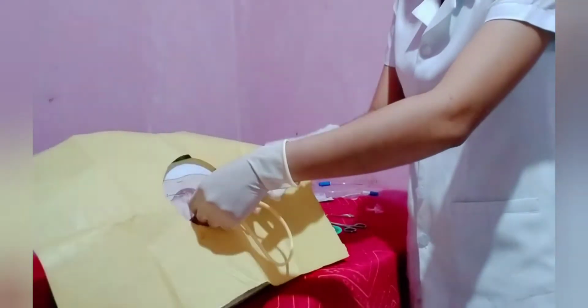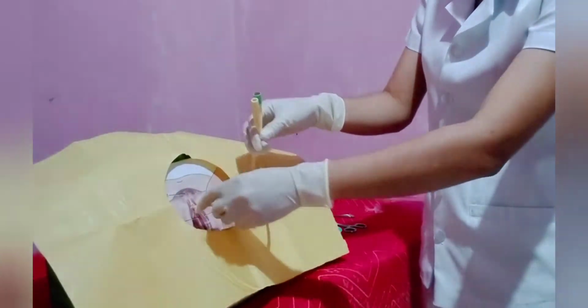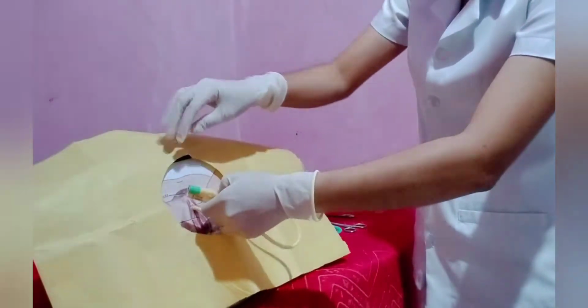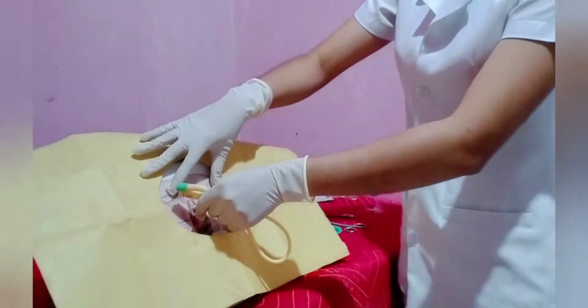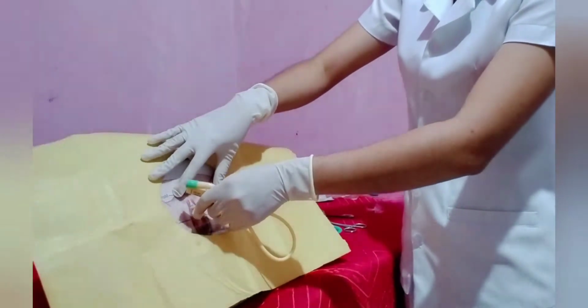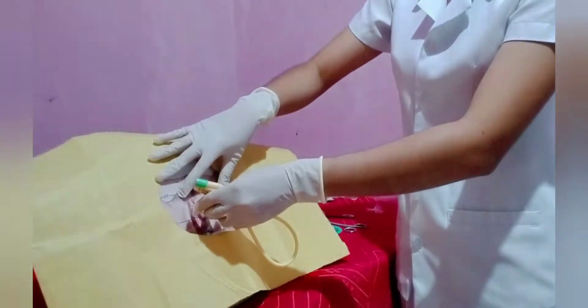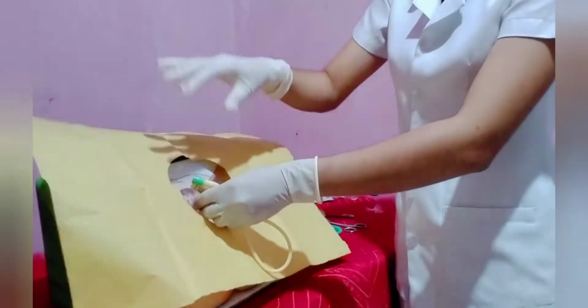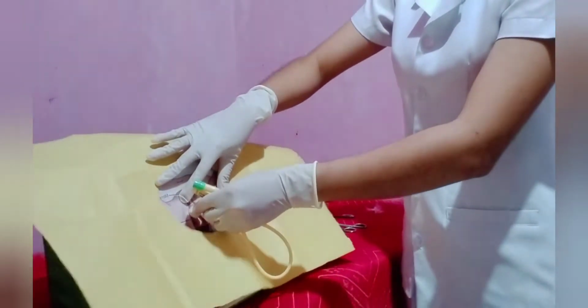So after that, rest the hand on the pubis area. Then, while holding the catheter in place to prevent pulling and pushing the catheter, withdrawing the catheter and pushing it back in the urethra increases the possibility of contamination of the urethra.